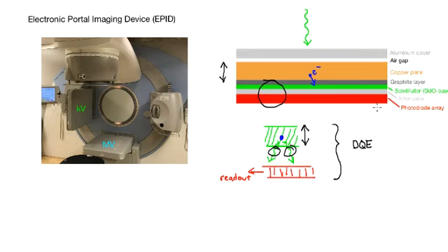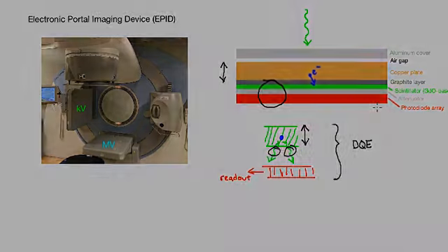But there are disadvantages to that as well. So a thicker area, you're spreading out the collection area over a bigger range, and so that essentially blurs out the image, makes the resolution lower. So there are trade-offs like that, and that can be quantified through this thing that I'm not going to get into, but it's called the modulation transfer function, which is essentially describing the responsiveness of the detector as a function of the frequency of images that you're trying to resolve, so that the spatial frequency.